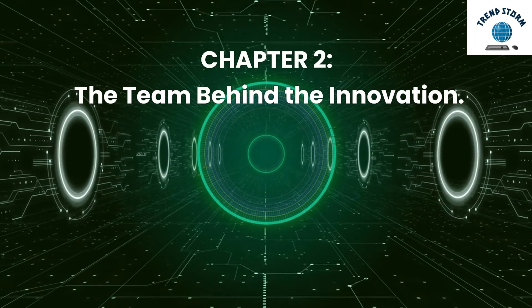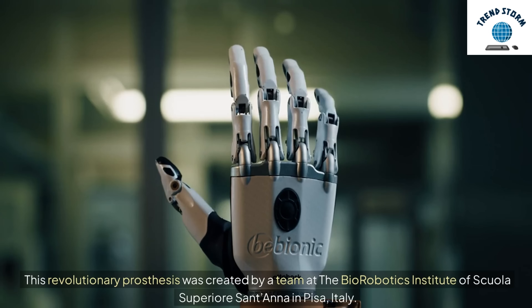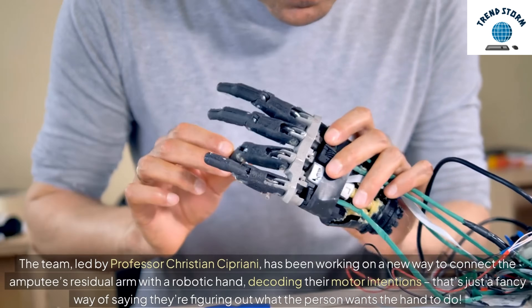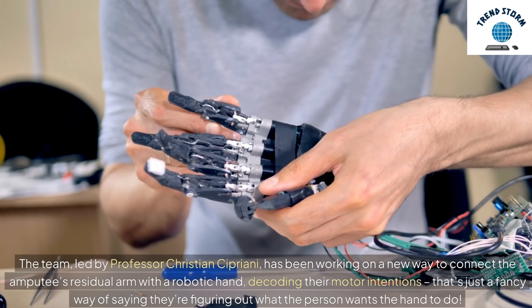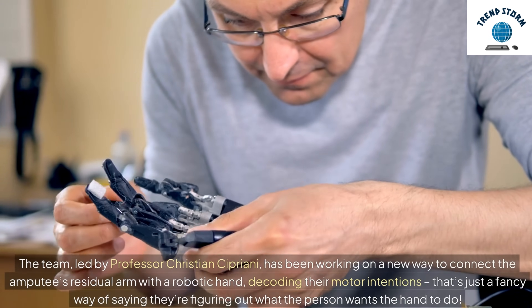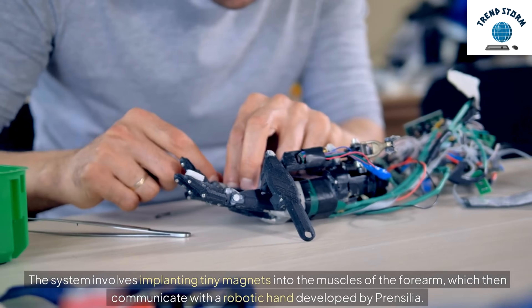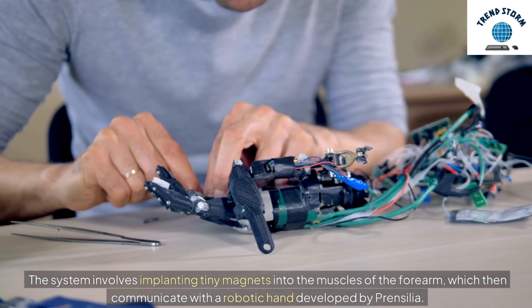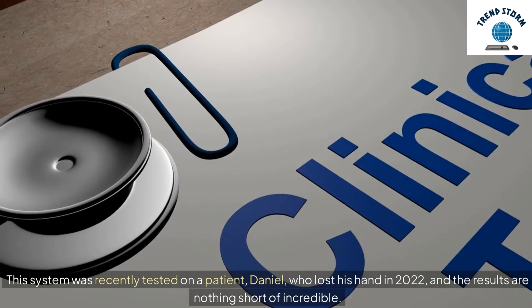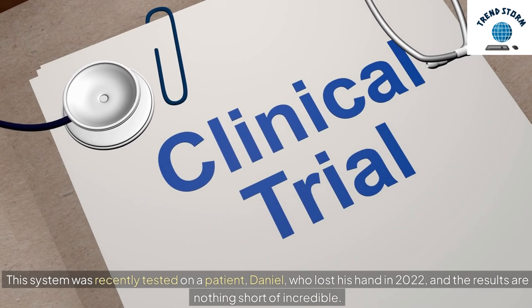This revolutionary prosthesis was created by a team at the Biorobotics Institute of Scuola Superiore Santana in Pisa, Italy. The team, led by Professor Christian Cipriani, has been working on a new way to connect the amputee's residual arm with a robotic hand, decoding their motor intentions — figuring out what the person wants the hand to do. The system involves implanting tiny magnets into the muscles of the forearm, which then communicate with a robotic hand developed by Prencilia. This system was recently tested on a patient, Daniel, who lost his hand in 2022, and the results are nothing short of incredible.